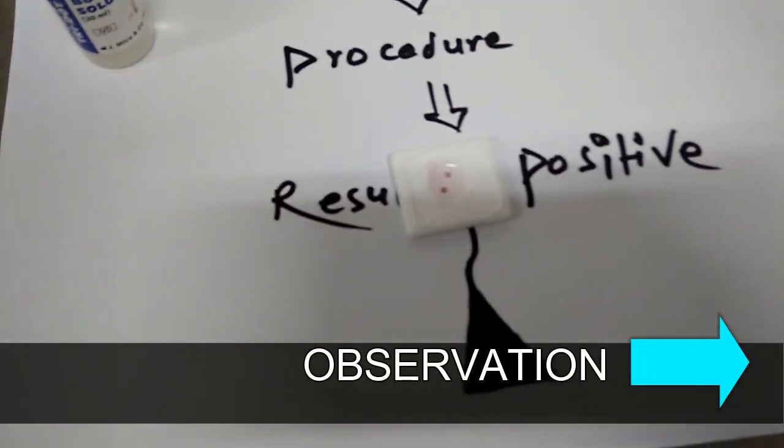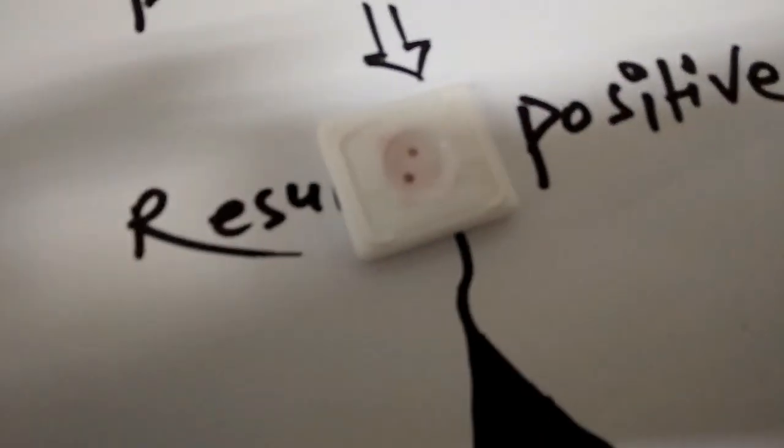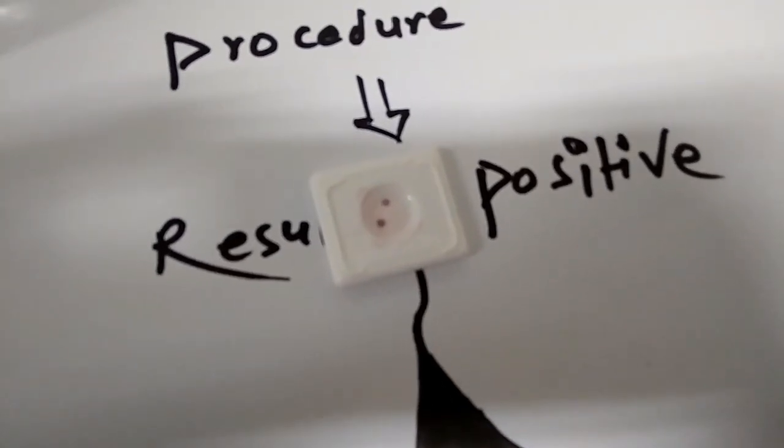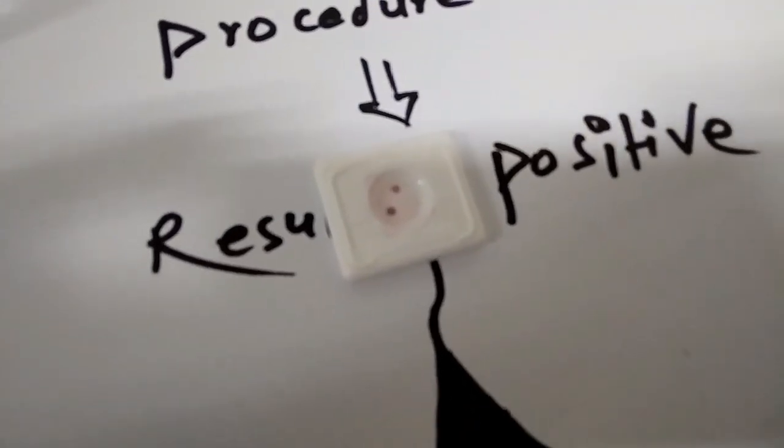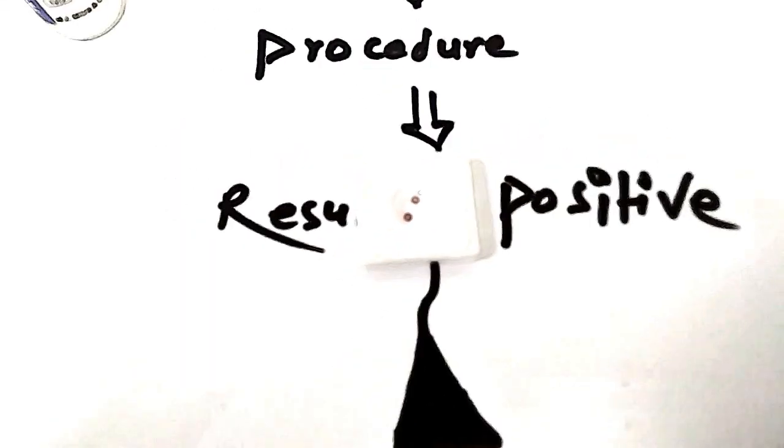About observation: a pink dot at the control region only means the test is negative. No pink dot, or a pink dot without the control region, means the test is invalid. Any dot including the control region means the test is positive.